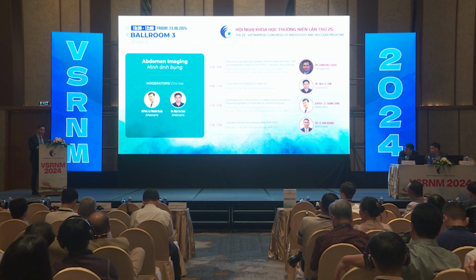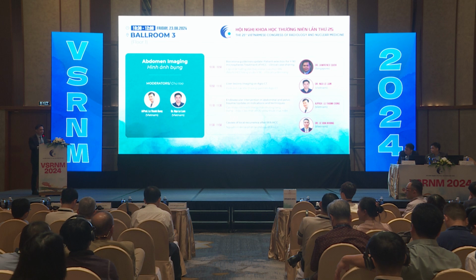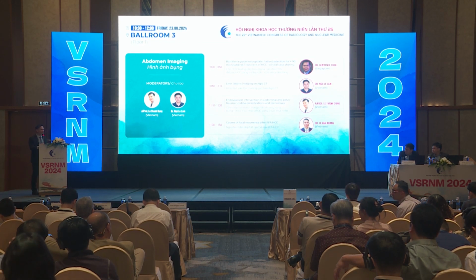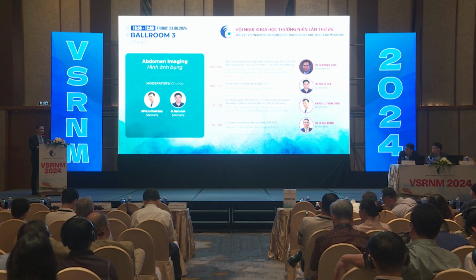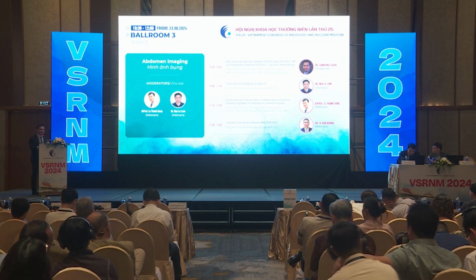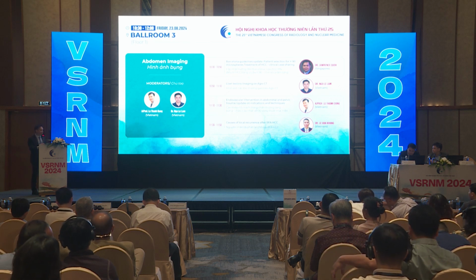Now, the reason why we use TheraSphere is because, when you're doing radiation segmentectomy, they were the originators of using glass microspheres to do radiation segmentectomy, and we kind of followed what the literature showed. We spoke to the experts in North America and followed their way of doing it. And certainly, we got used to using TheraSphere for delivery. But if we are looking at doing a lobar treatment, meaning that we are doing palliative work, we need more microspheres, and in that sense, resin microspheres are what we will use. So we actually use both compounds.